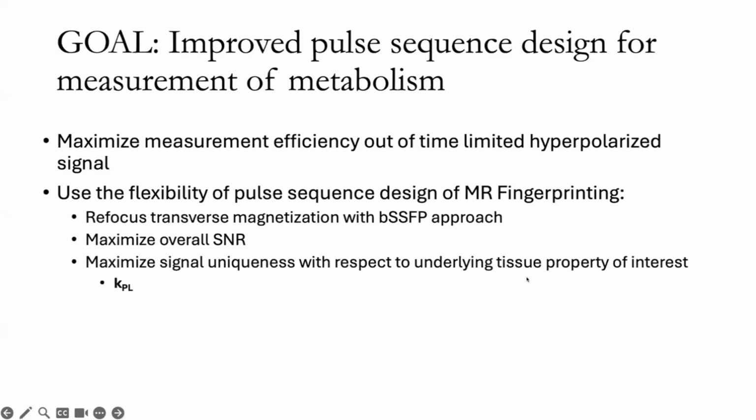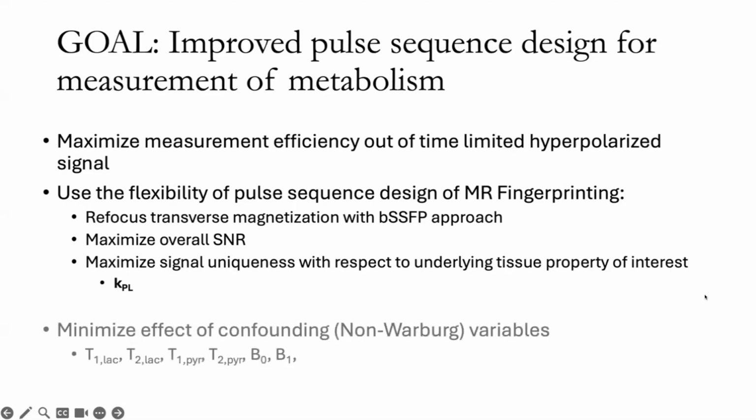My approach to this is that I am a big fan of the paradigm of MR fingerprinting for pulse sequence design. In these particular cases, I like the balanced steady-state free precession approaches for the high SNR efficiency, to maximize overall SNR, and leveraging that to drive the signal uniqueness to the underlying tissue property of interest, in this case, the pyruvate to lactate forward rate constant.